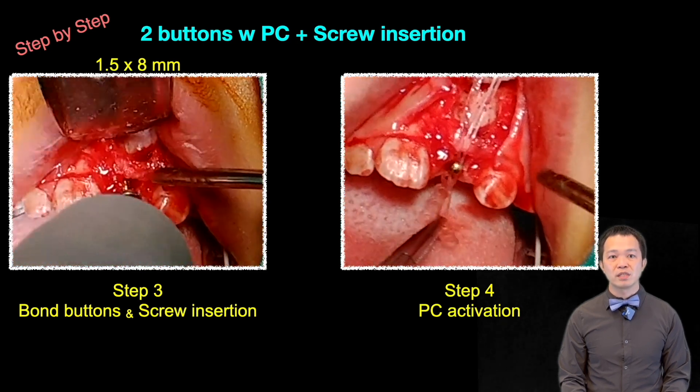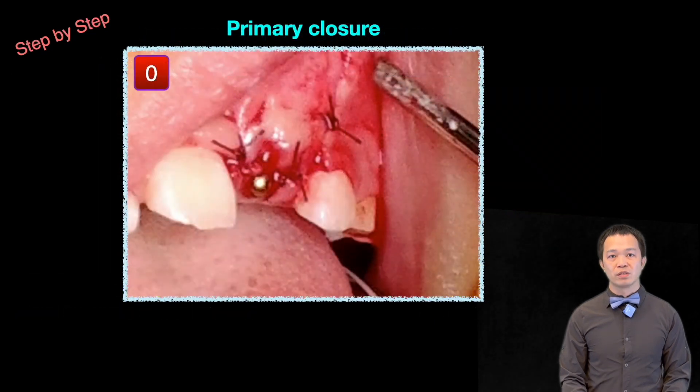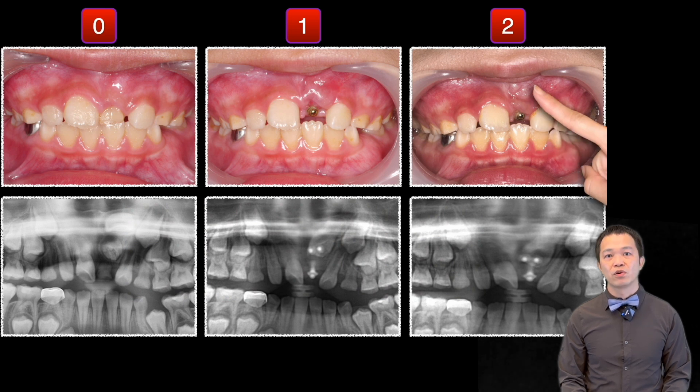Then I looped the power chain around the mini screw head. Finally, I closed the wound with primary closure. Have the patient return every month for reactivation by tightening the power chain.